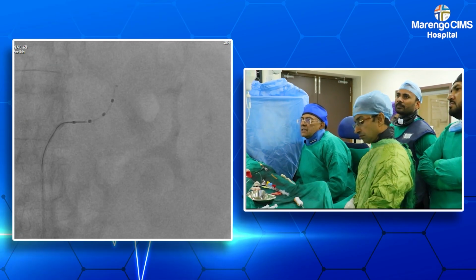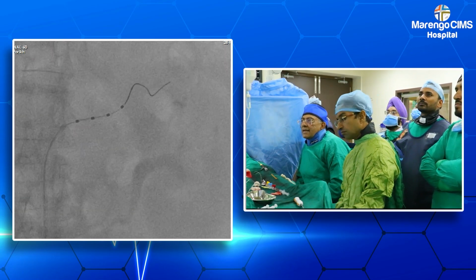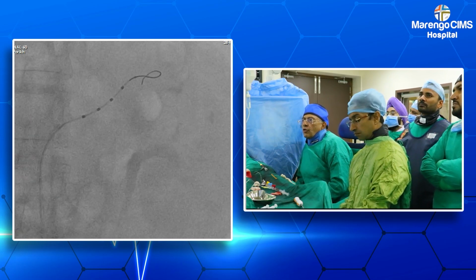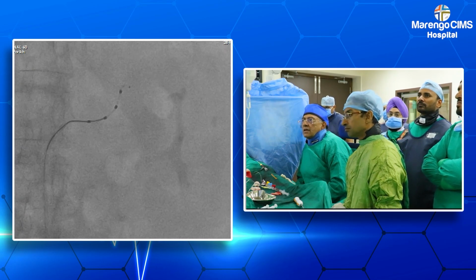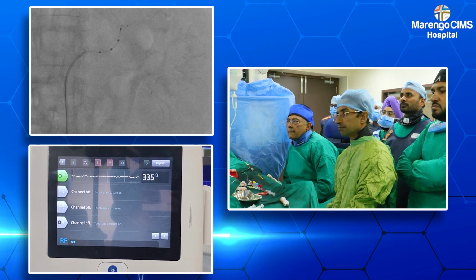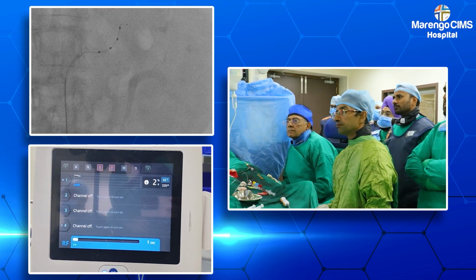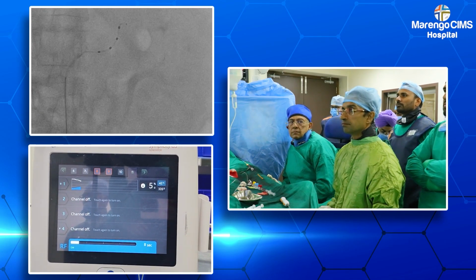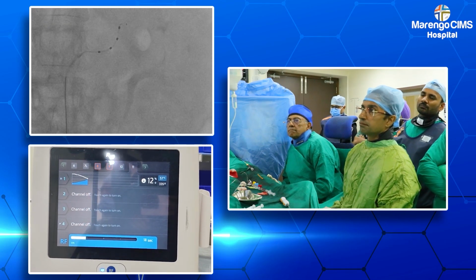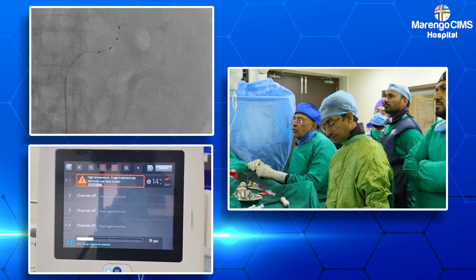We abandoned earlier due to the heat and temperature, and I'll ask Dr. Vipul to re-ablate that area with slight repositioning with the electrode slightly proximal, hoping that the flow of the blood there will be able to keep the area cool enough. So let's start the ablation. We'll switch off the channel 2, 3 and 4. So again, it has gone up and it has auto shut off.